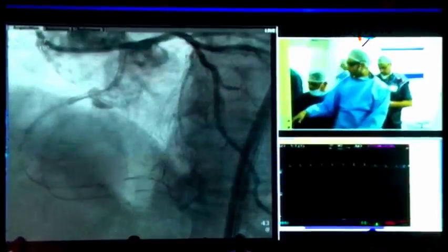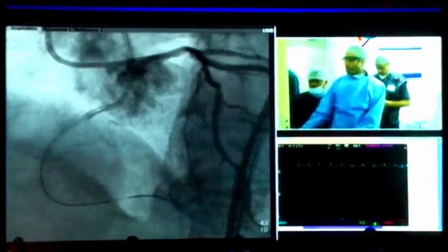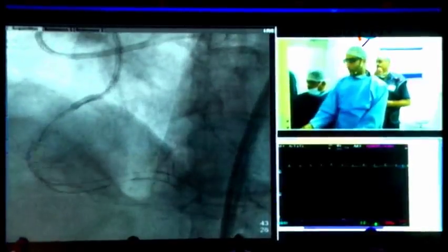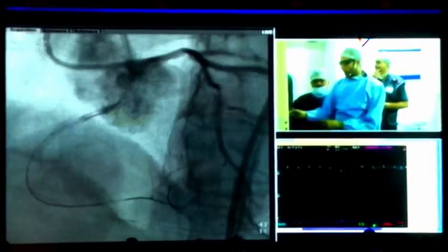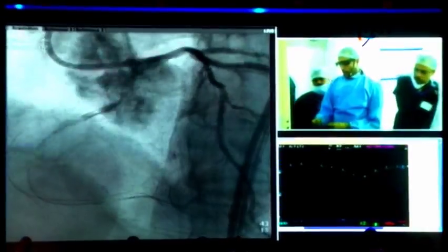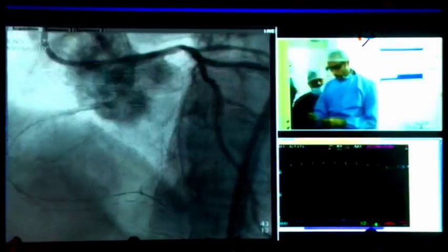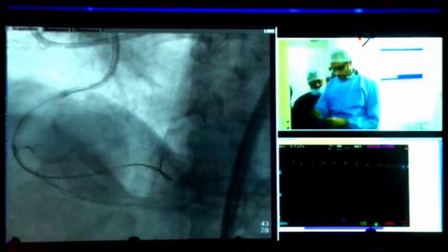If it is not in the true lumen, will you take a parallel wire technique now? If it's not true lumen, I probably would just Stingray it, but I think parallel wire is not a bad option. Ideally, I like parallel wire with Crusade, so without Crusade, I'm a little bit on the fence. Your first choice will be retrograde. If it is not, you'll be going for a Stingray. No, or actually, parallel wire.